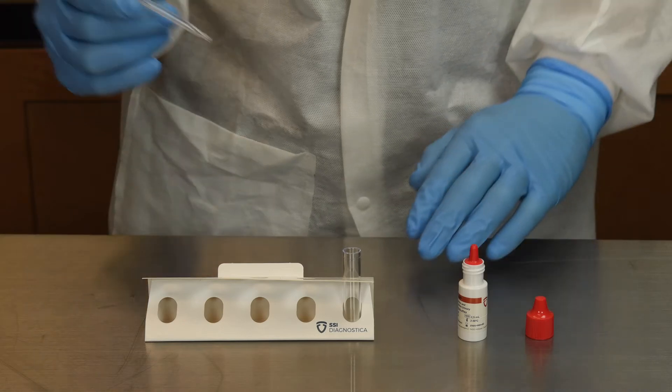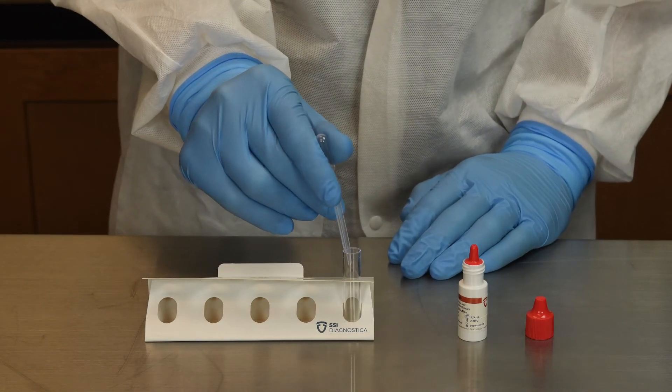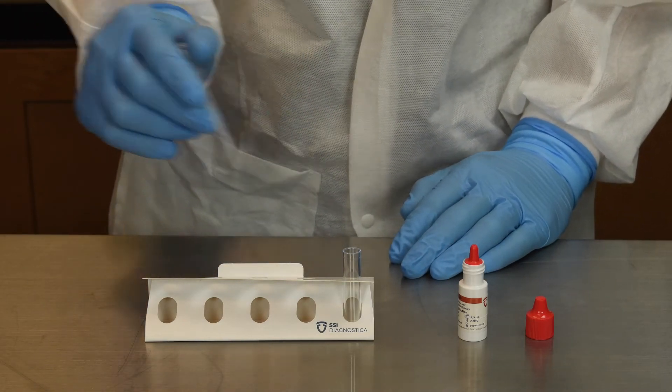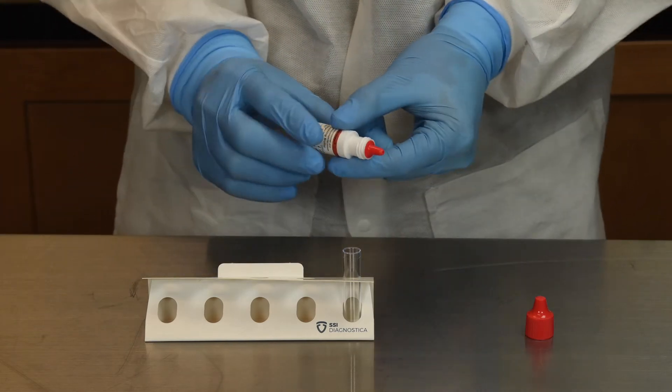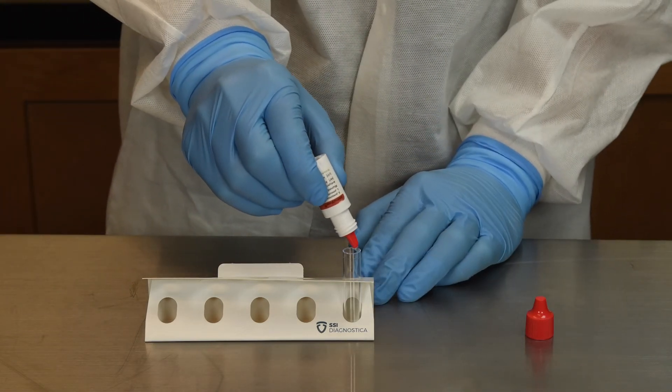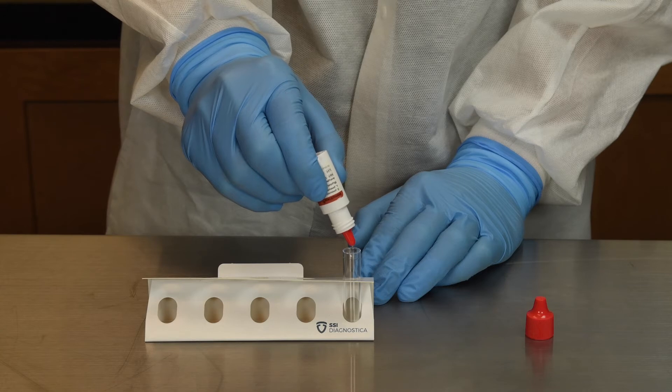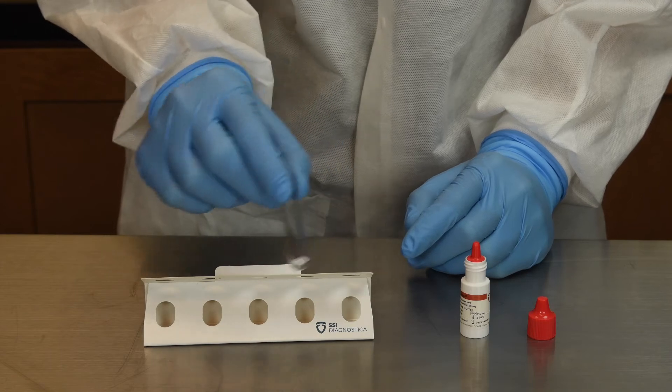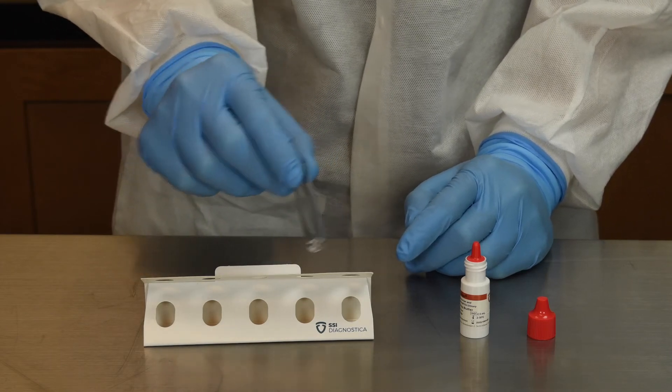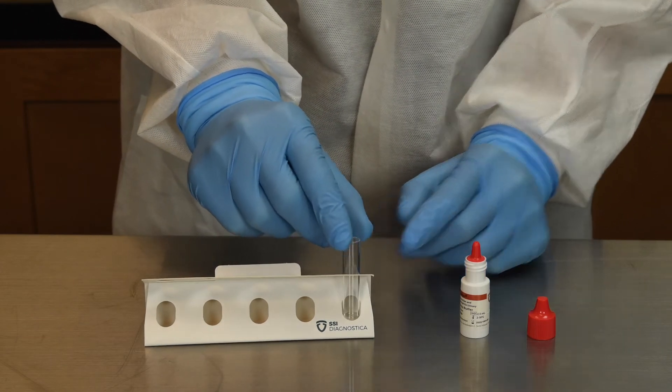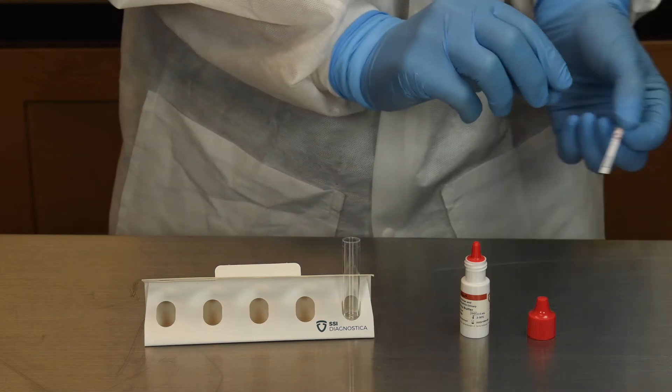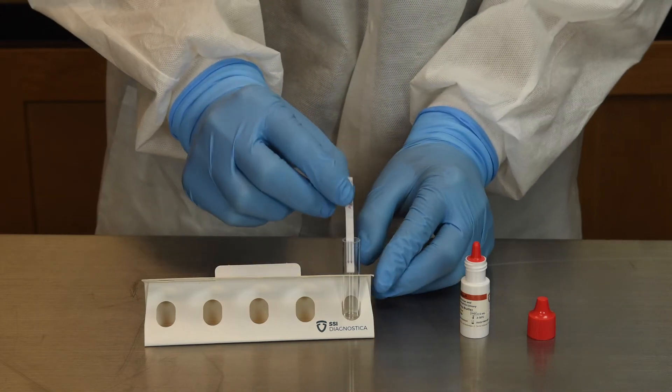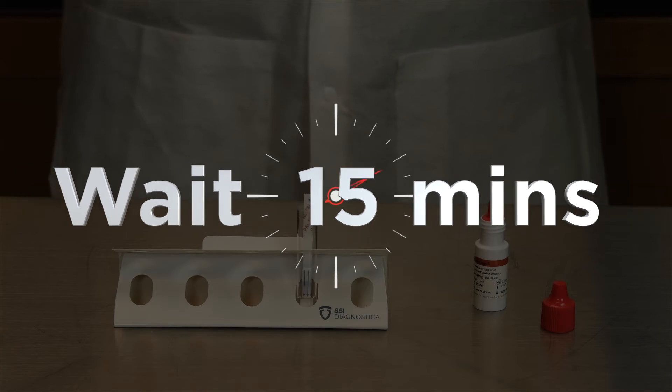Once your QC is complete, you can follow three simple steps for results. First, add three drops of your sample material, either urine or CSF, into your tube. Next, add two drops of the running buffer. Whirl the test tube gently to mix the buffer in with the sample. The third step is to add the ImmuView test strip into the tube. Then wait 15 minutes.